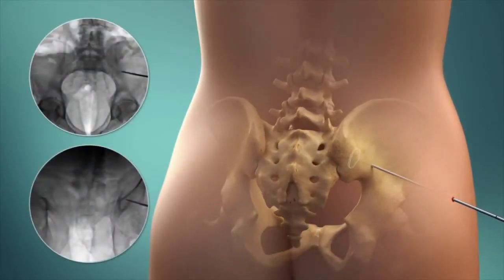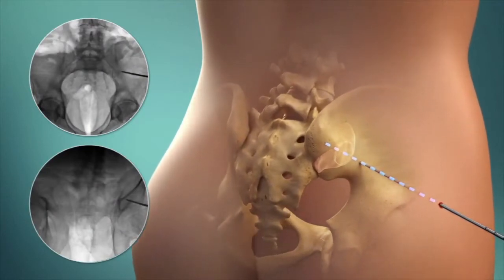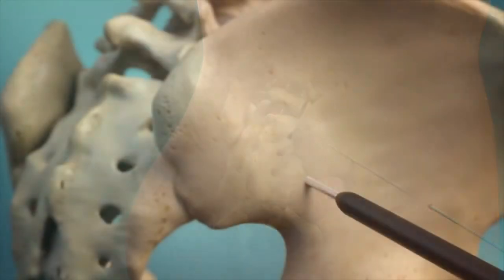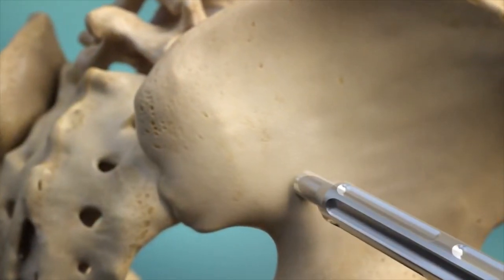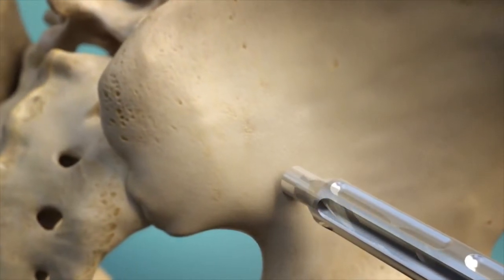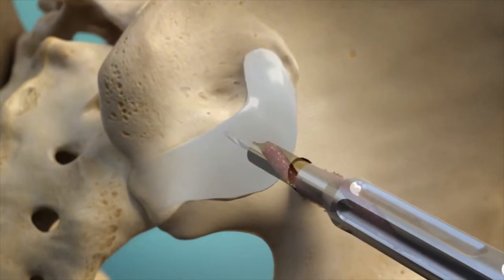To begin, a guide pin is used to target the SI joint and ensure a final position within the safe zone of the sacrum. A dilator and working cannula are then inserted to create a channel through which a drill accesses the joint. The drill flutes collect autologous bone from the ileum for later grafting.